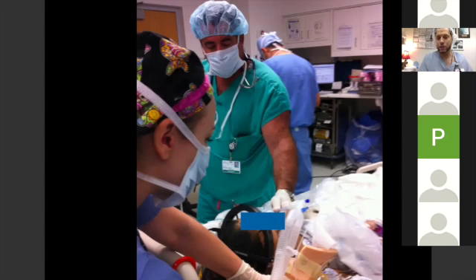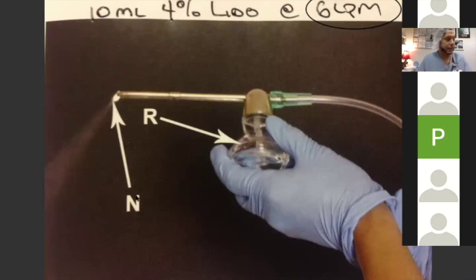So you put the patient to sleep, put a bite block in, you bag them, you have them check motors, you intubate, check motors again, no change, the problem wasn't from your intubation. So these are all things to talk about. All right, let's get into technique, because we've got a short lecture today.